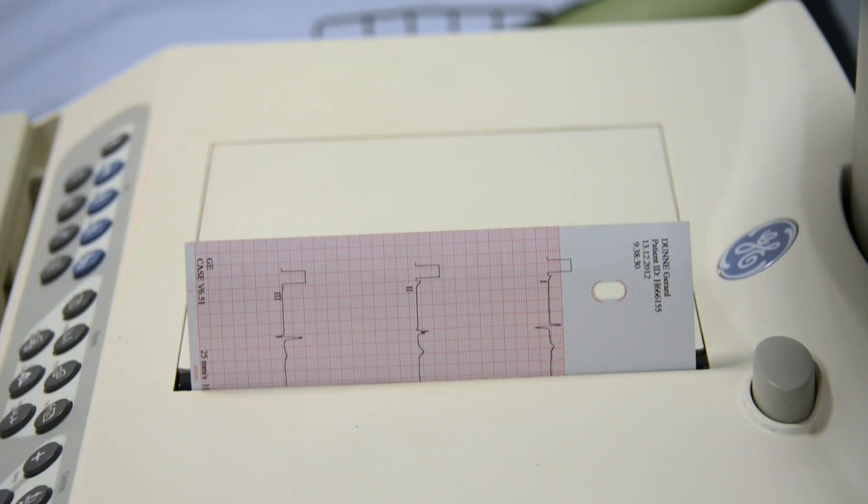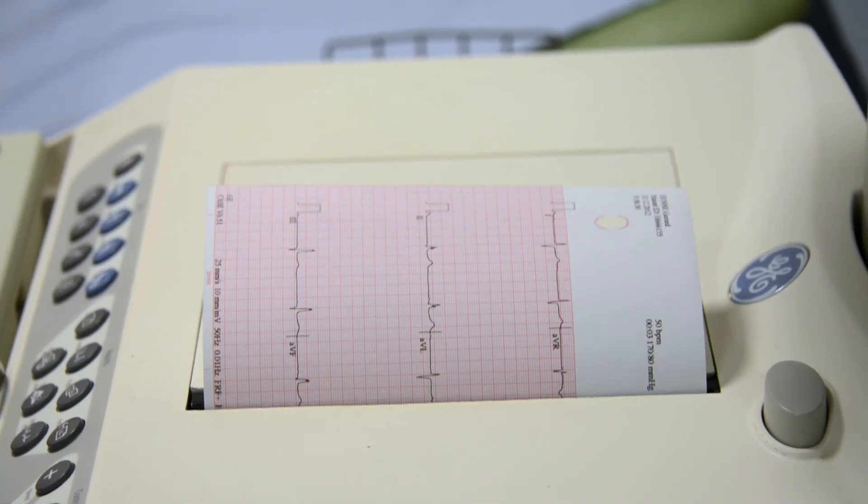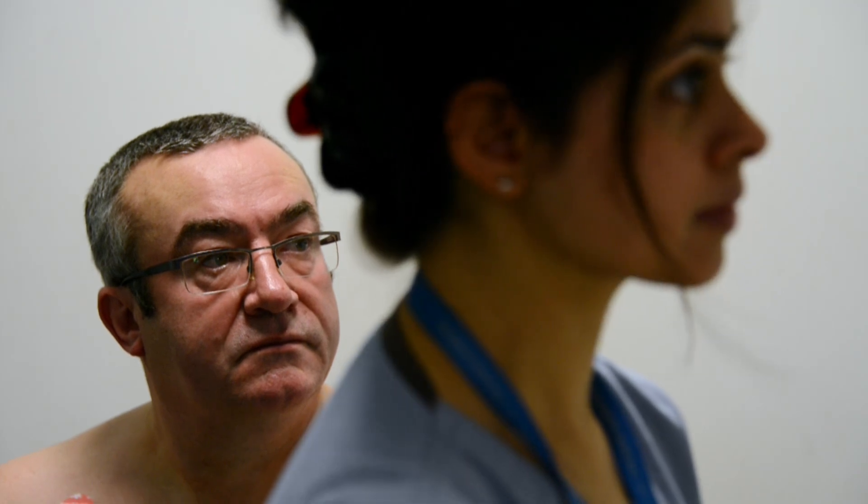Once the blood pressure, heart rate and ECG go back to pretty much as it was to start with, we end the test and then the results are sent to the doctor.